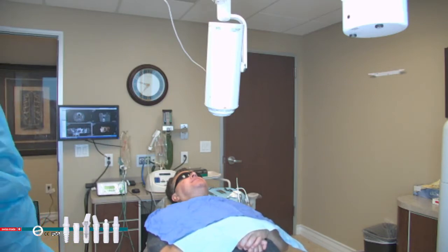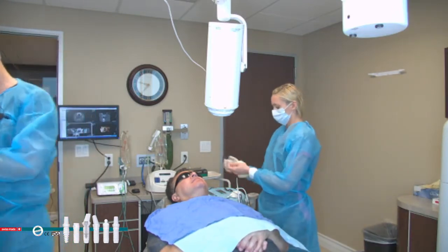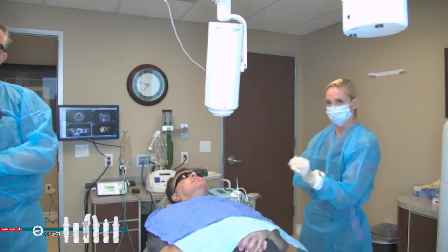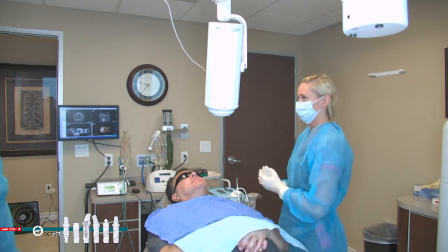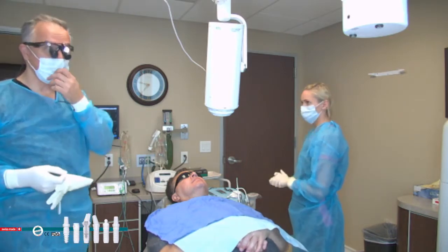We're learning a lot today. Any questions coming in yet? We had one asking if they were placing another titanium implant or a zirconia implant, and someone had already responded, I believe. You want to reiterate? The question was if we were replacing another titanium implant? No. We're phasing out his titanium implants.